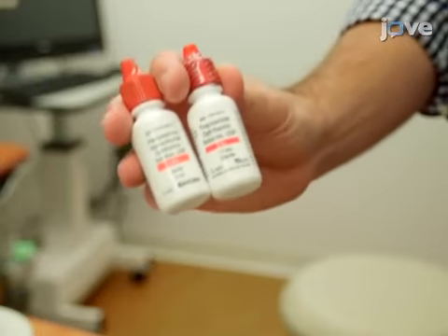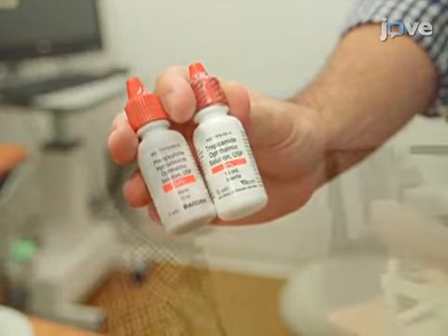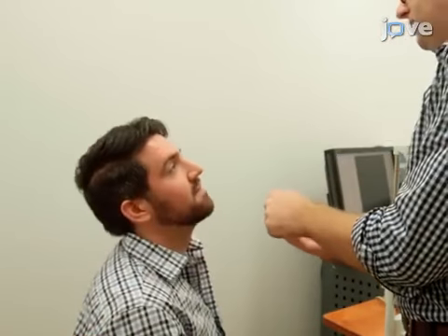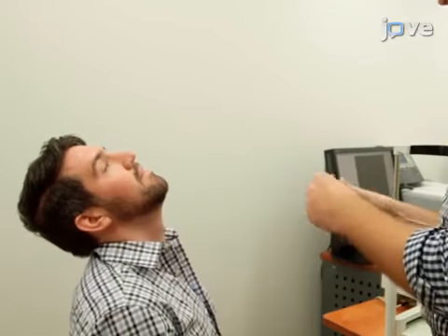It is essential for pupils to be dilated to at least 6 millimeters for uninterrupted passage of light. With 0.5% tropicamide and 2.5% phenylephrine, dilate the patient's pupils at least 6 millimeters, which is essential for uninterrupted passage of light to see and measure the fundus.